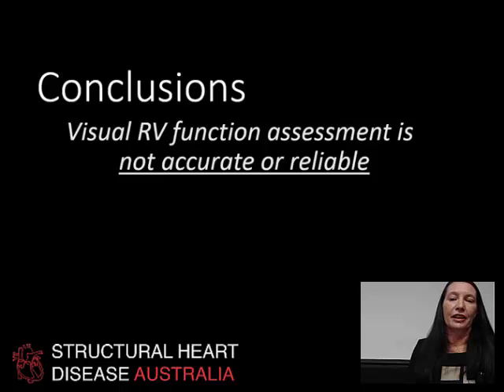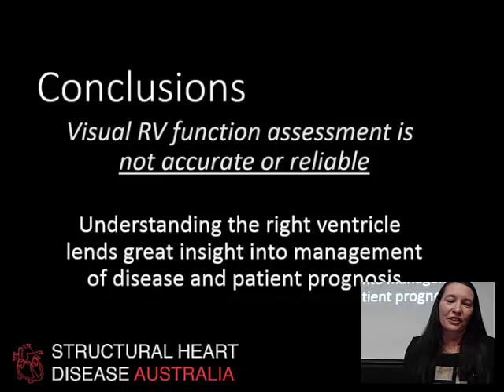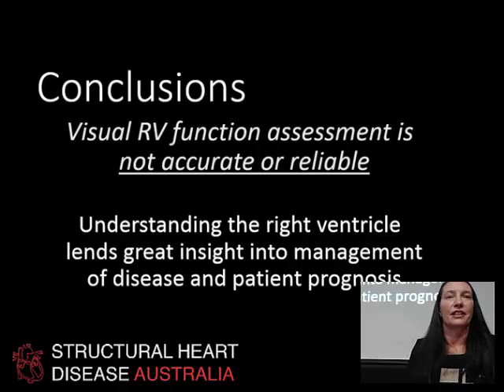And visual RV function doesn't cut it anymore. You can't say it looks okay. Understanding the right ventricle lends great insight into the management of disease and patient prognosis.